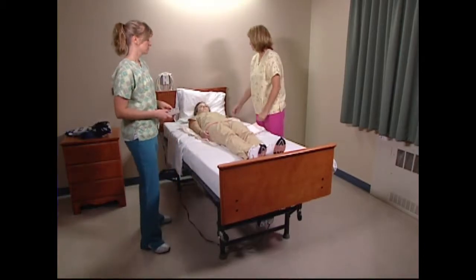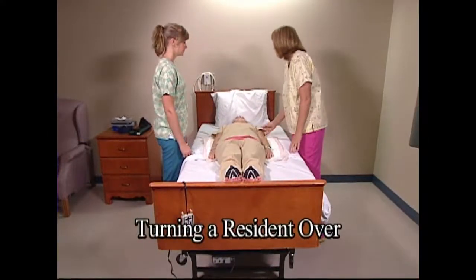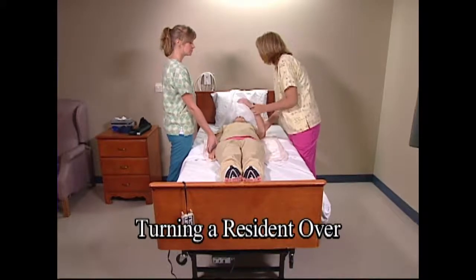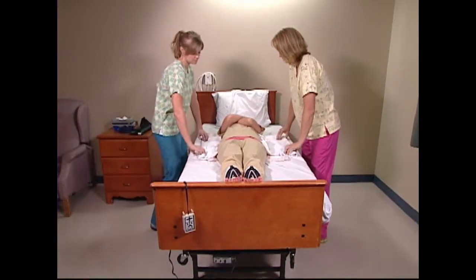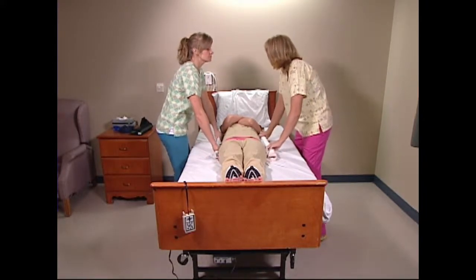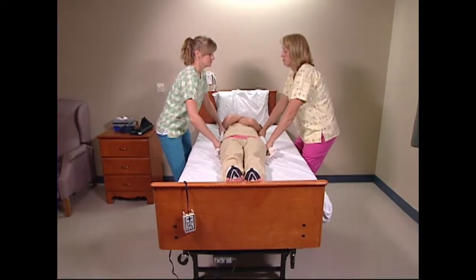Lower the bed to resident care plan height. To roll the resident onto their right side, ask them to cross their arms. Using a draw sheet, shift the resident away from the direction of the roll toward the opposite side of the bed. On the count of three, slide the resident over toward you.